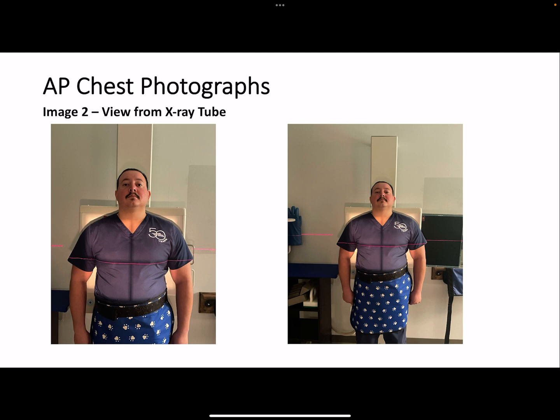Visual of appropriate marker location. For this image, I placed the right marker in the upper right corner just above the clavicle, so it is in the image, but doesn't impede any anatomy of interest. KVP range for the real patient, 110 to 125 KVP.